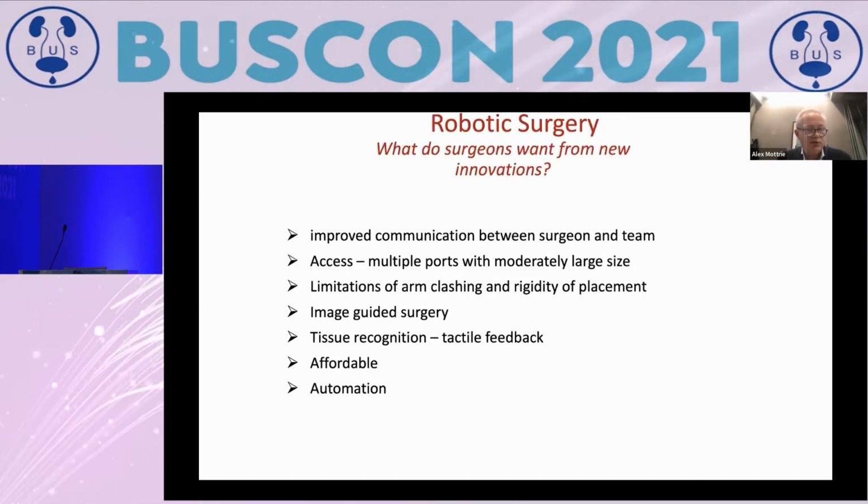In 2017, with my good friend and colleague Vip Patel, during the Society of Robotic Surgery meeting in Orlando, we had a session together about innovation in robotic surgery, and we asked the surgeons present, what do you actually want to see when new innovation is coming into robotics? Number one was improved communication between surgeon and team, and the access. We have nowadays multiple ports with moderately large size that should be improved.